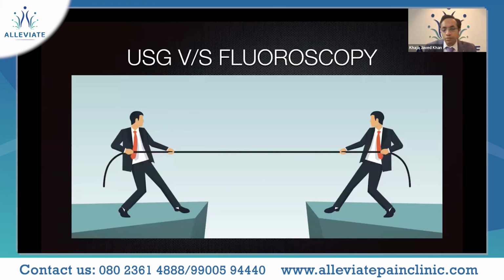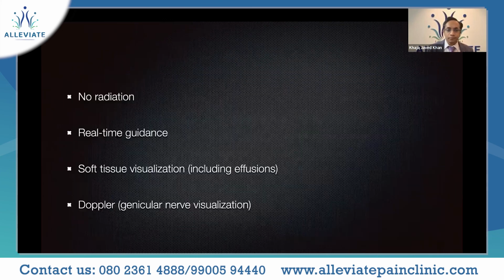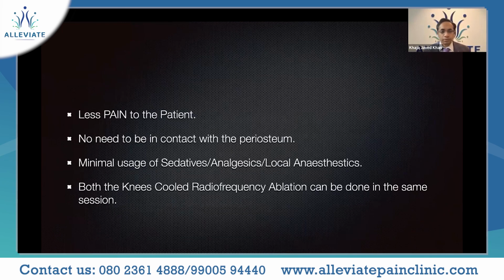Right. So let's see which is better, ultrasound or fluoroscopy. With my experience, ultrasound is definitely a better modality for radiofrequency ablation, at least. How is it better? One, there's no radiation. Real-time guidance is what is done. Soft tissue visualization is possible, wherein even effusions can be visualized. The Doppler helps in genicular nerve visualization, as the nerves are close to the vessels, the artery specifically. There's lesser pain to the patient.